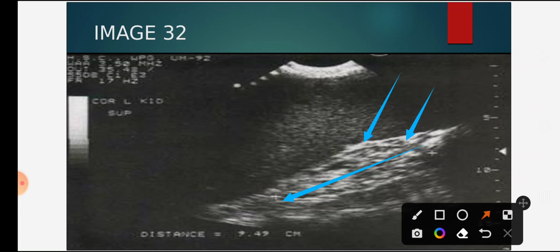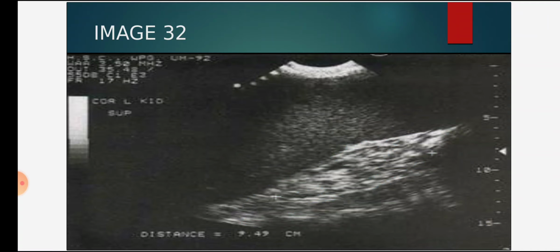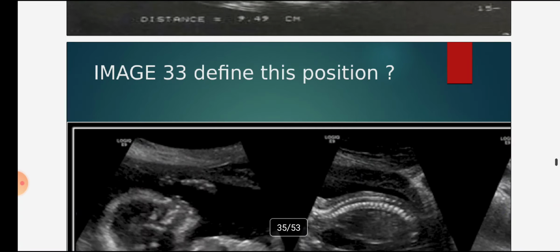Poor visibility of the renal pyramids and the renal sinuses; the pyramids cannot be seen. The margin is unreliable, and there is no rounded shape. Pelvic calcification, internal calcification inside this kidney, and cysts. See also the acquired cystic disease inside this kidney, a feature of chronic kidney disease.